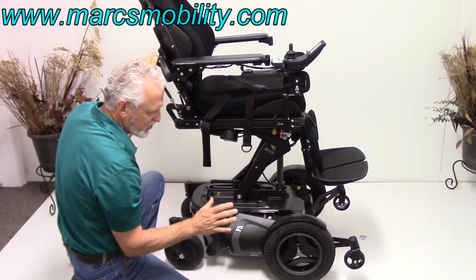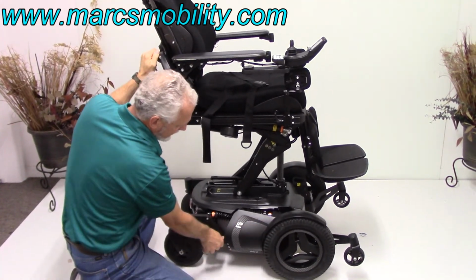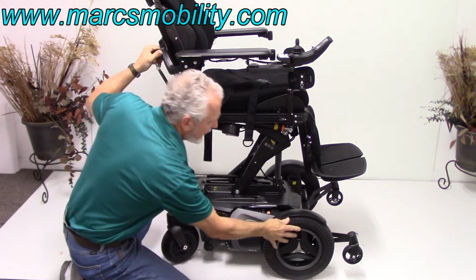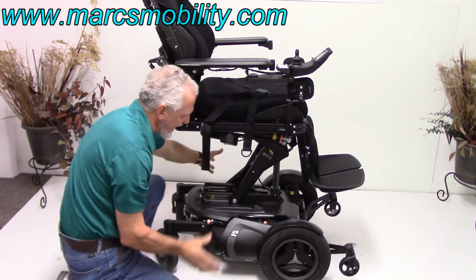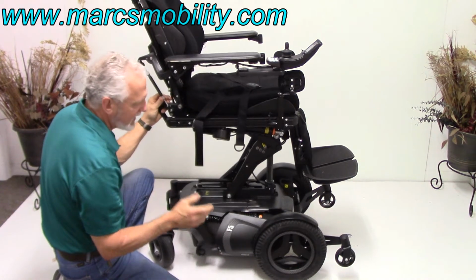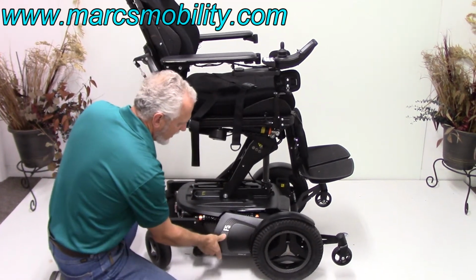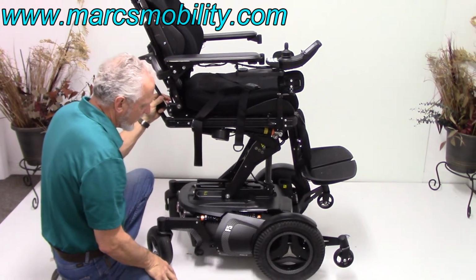If I want to put this chair in neutral right now, I can't push it because it's in gear. But if I push this lever down, like this, and make sure to turn the power off. If the power is on, you'll have resistance in the wheel. Now you're in neutral. So you have to put both motors on both sides down, then you can push it forward. Remember, this chair weighs roughly around 400 to 425 pounds. So it's a lot of metal here, 400 to 425 pounds. Put it back in gear, turn your power back on, and you're ready to go again.